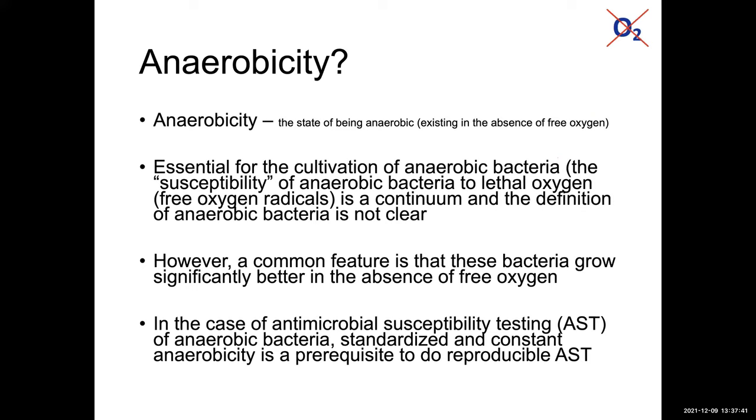Yes, what is anaerobicity? Well, that's the state of being anaerobic. It is also referred to as anaerobiosis, and that means existing in the absence of free oxygen. And that is absolutely essential for the cultivation of anaerobic bacteria. We probably know that the susceptibility of anaerobic bacteria to lethal oxygen, which is actually free oxygen radicals, is a continuum. And the definition of an anaerobic bacterium is not absolutely clear. You will probably all know from experience that some anaerobic bacteria will die at very low levels of oxygen, and some can survive at, let's say, 1 or 2% oxygen but will not multiply. However, a common feature of what we call anaerobic bacteria is that they all grow significantly better in the absence of free oxygen.